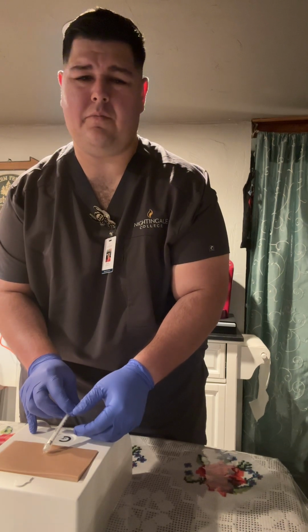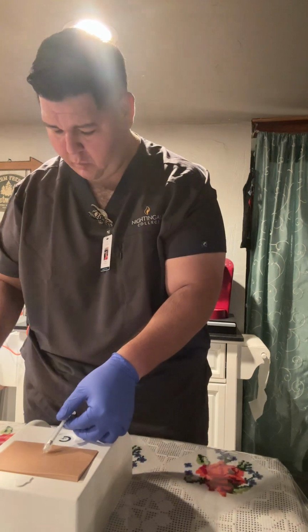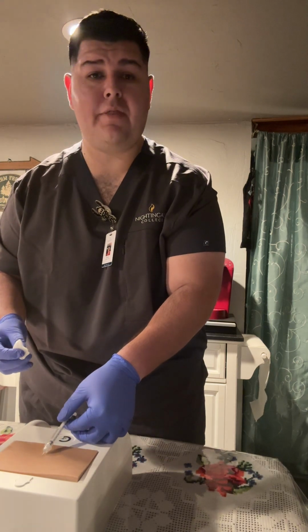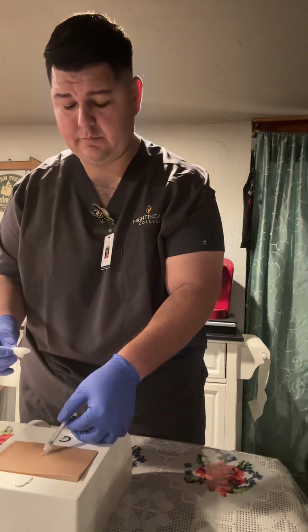Okay, almost immediately I see a small blob that's about 6 to 10 millimeters in size. It resembles almost a mosquito bite. Okay, at this point, I want to grab my gauze and I start the removal of the needle. I want to gently apply the gauze pad to the top and dispose of the needle in my sharps container immediately. So here we go.